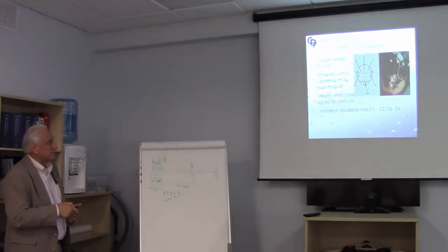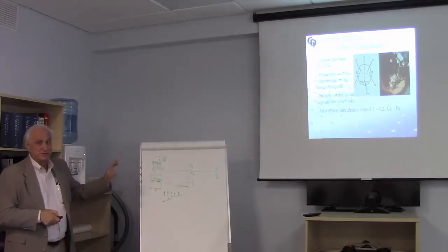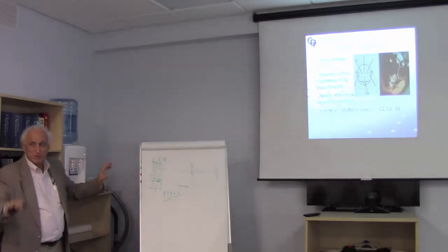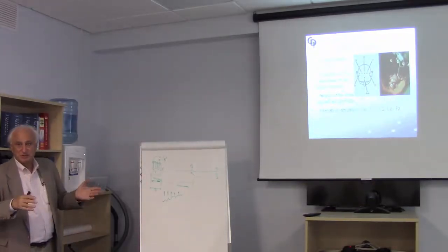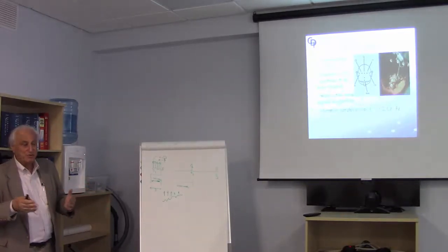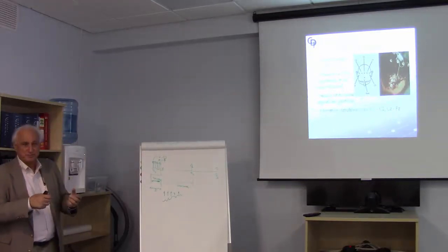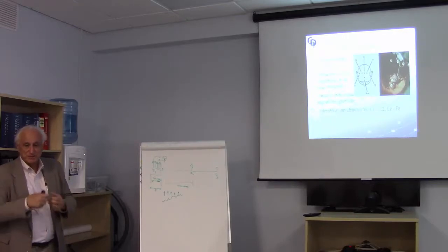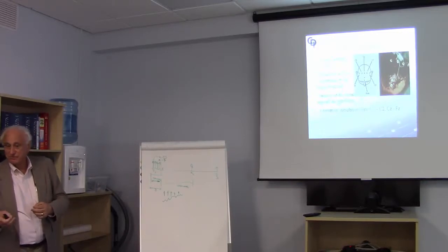The responses in general will be produced contralateral to the anode electrode. So if C3 is your anode electrode, C3 is on the left side, so you can expect to see the motor responses produced on the right side. Now, occasionally you'll get a patient where it doesn't matter which side is their anode, they're going to respond appropriately, and we think that's because of the thickness of their skull, the musculature they have, all the things that interfere with the flow of this current through the brain.